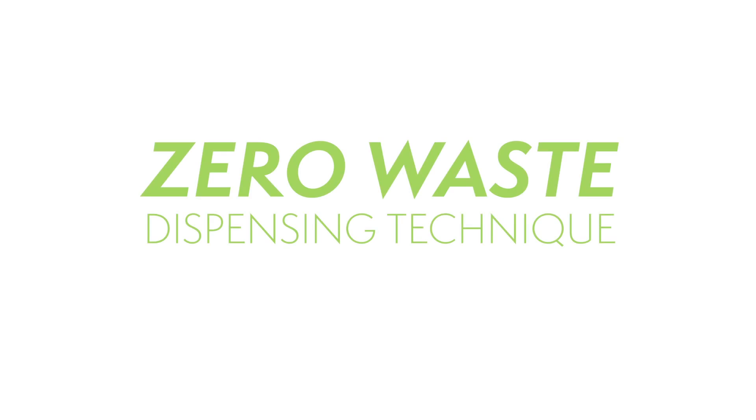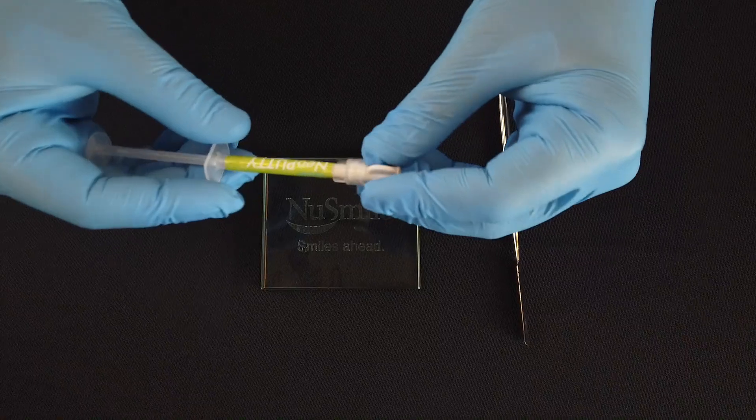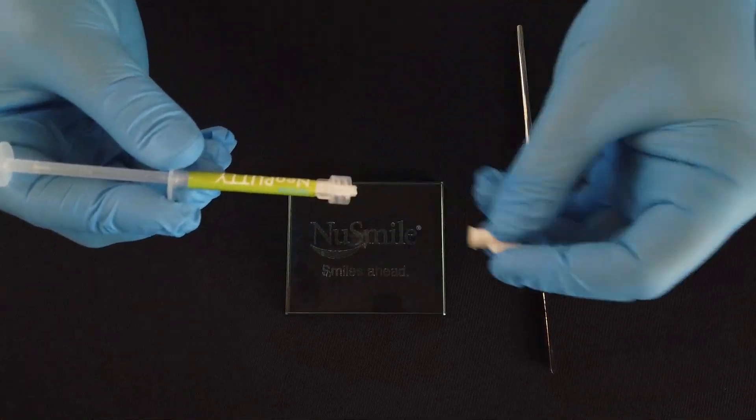Our zero waste dispensing technique ensures perfect dose size. After removing the Neo putty from the packaging, unscrew the top and follow these instructions.